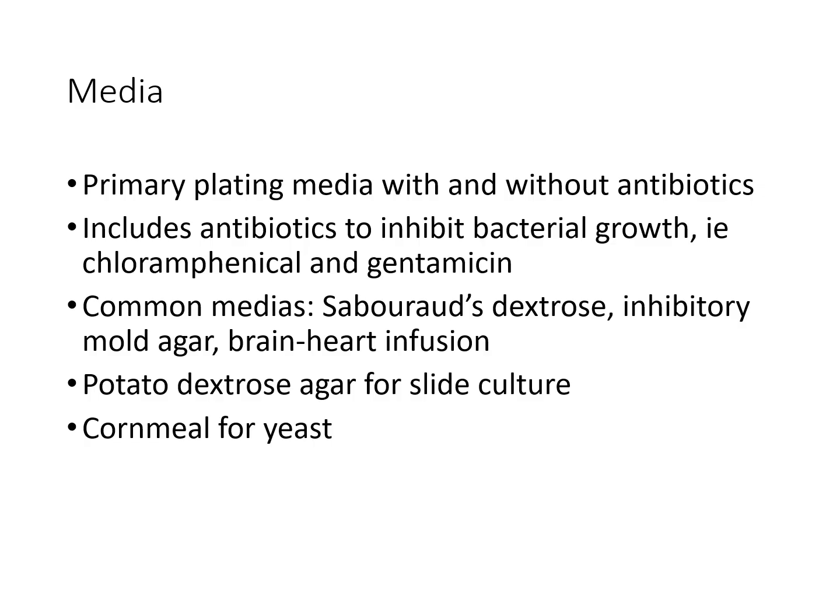SDA has an acidic pH that favors fungal growth while partially inhibiting bacteria, and it is often supplemented with antibiotics for better selectivity. Inhibitory mold agar contains antibiotics specific to suppress bacterial contaminants and promote mold growth. Brain heart infusion agar is a nutrient-rich medium that supports fastidious fungi and can also be supplemented with antibiotics to reduce bacterial interference.